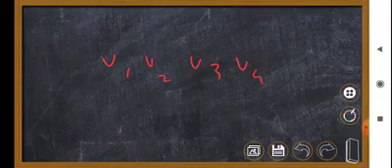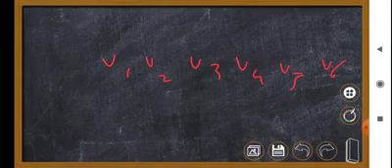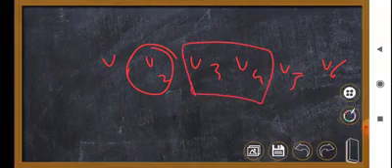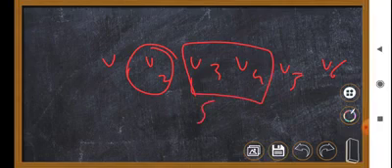Now coming again to precordial leads V1, V2, V3, V4, V5 and V6. V2 is almost just on top of the heart, the center of the heart, and V3 and V4 are almost on the interventricular septum, and V5 and V6 are more towards the apex of the heart. So gradually we see that the R wave is elongating, and this is called the progression of R wave.